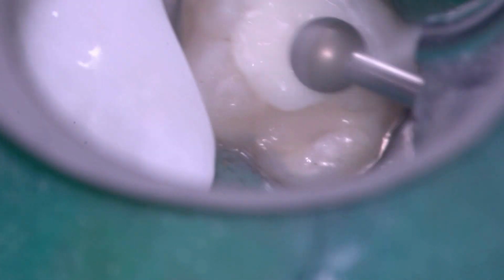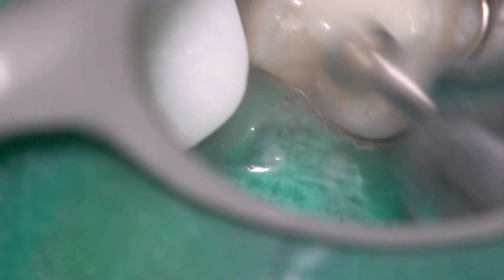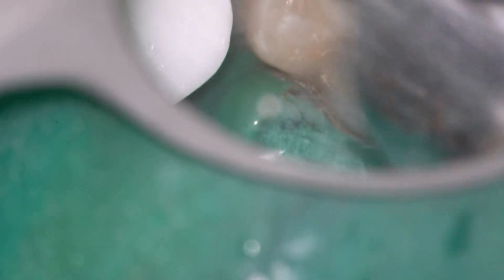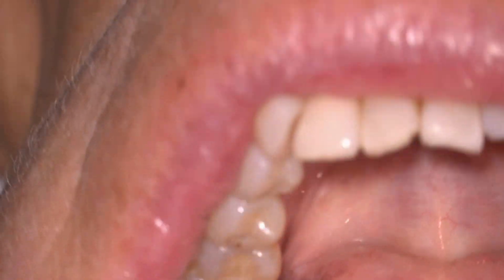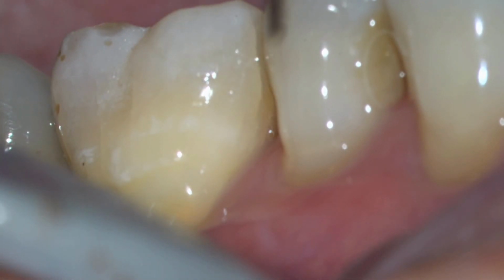So for the final step, take off the shield, and now we just use a large round bur to flatten it down and have a nice contour. And then after contouring the overbulked LuxaCore, I inspect it. Take the rubber dam off, and then we'll go ahead and check the occlusion.